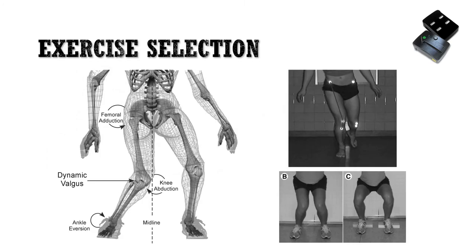The more traditional way in which we sometimes think of EMG analysis would be exercise selection, and don't get me wrong, that's equally important. So here we're looking specifically at knee valgus. Now, knee valgus is quite a complex phenomenon.